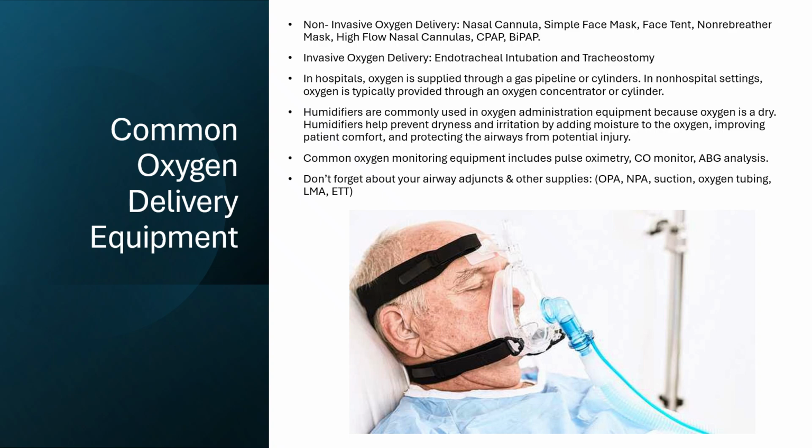If you're working in the hospital, oxygen is typically supplied through a gas pipeline or cylinders, and in non-hospital settings, typically patients at home are going to have oxygen concentrators or potentially little cylinders too. Humidifiers are commonly used in oxygen administration because oxygen is very drying, and humidifiers help prevent dryness and irritation by adding some moisture to the oxygen. This helps with patient comfort, protects the airways from potential injury, and prevents mucus plug growth, especially in your trached patient.